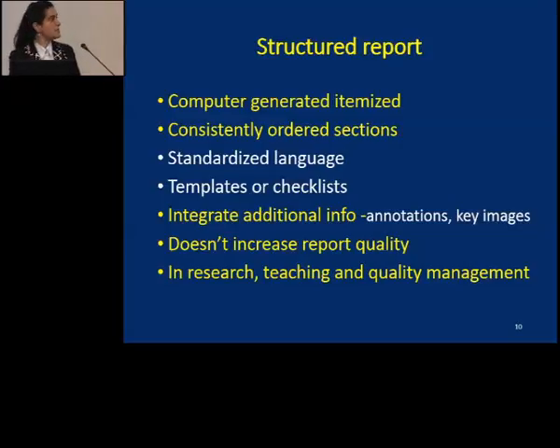This can also integrate additional information in terms of annotations and also key images, which are quite important for our neurologists or neurosurgeons, because we can pick up, let's say, 5, 10 images out of 200 or more. But you should remember that it doesn't increase the quality of the report. So the main positive things are connected with researching, teaching, and quality management.